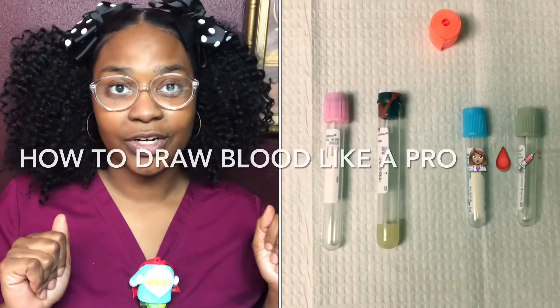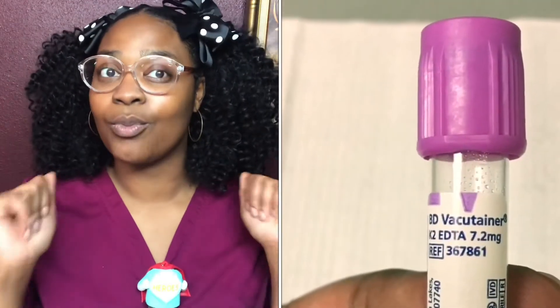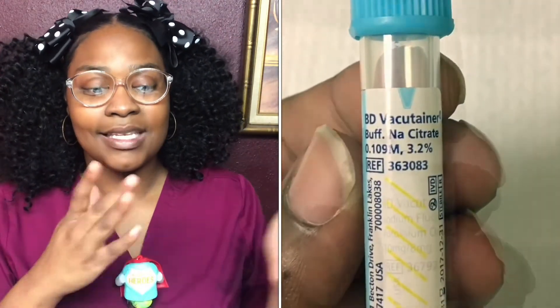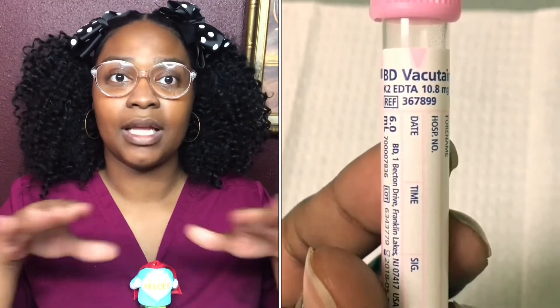What's up YouTube, it's Desi and I'm back on another video. In this video I'm going to talk to you guys on how to draw blood like a pro when it comes to phlebotomy. I am a visual learner so I will have some videos and pictures to show you guys what tubes and everything will be used during phlebotomy. This is to show you step by step the easy process of things to remember when drawing blood.